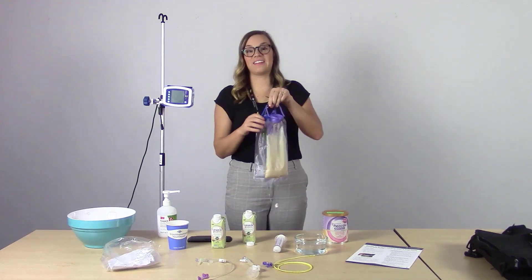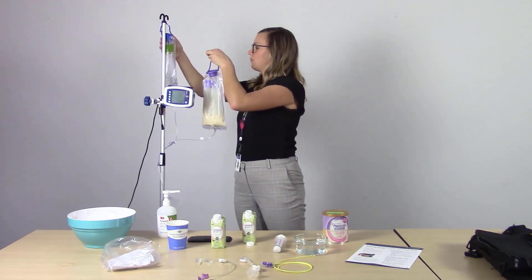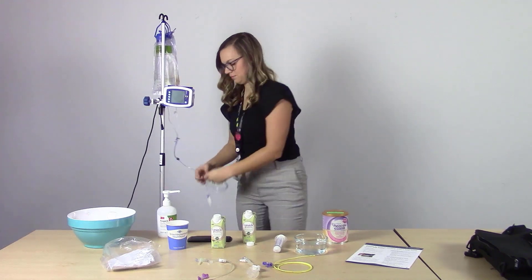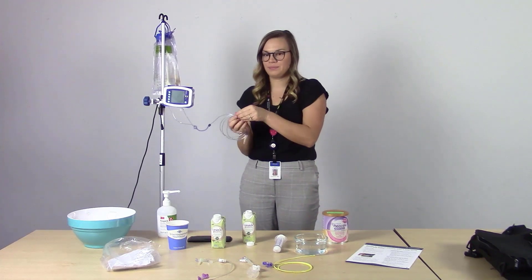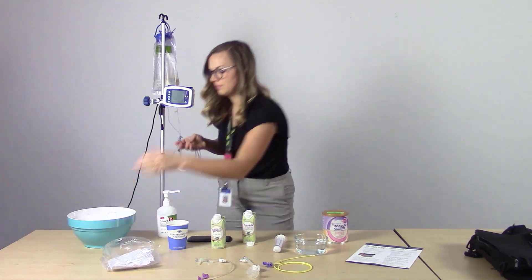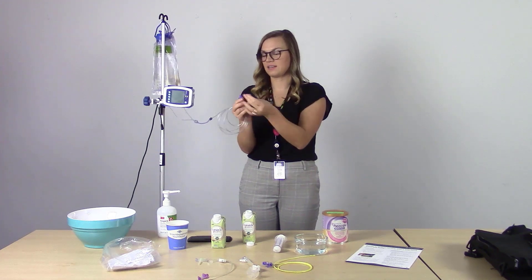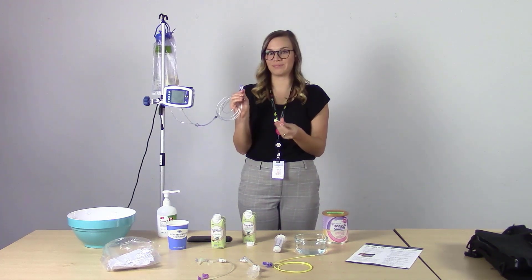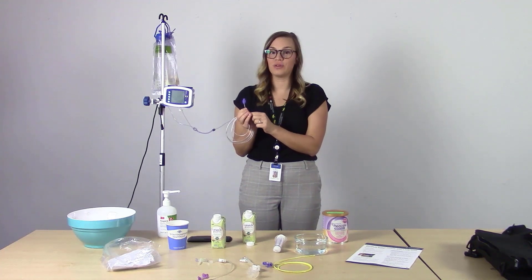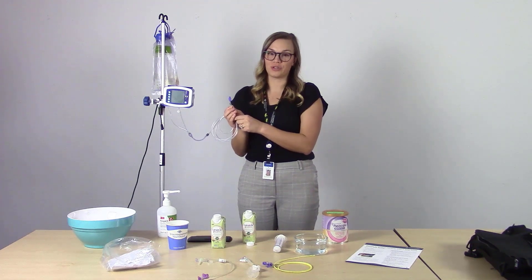Now we're ready to hang the Feed and Flush Bag on the IV pole. Remove the paper tape, and also remove the end cap on the end of the tubing. If you find that your tubing does not connect easily to your feeding tube, please contact our enteral team for additional help with troubleshooting.